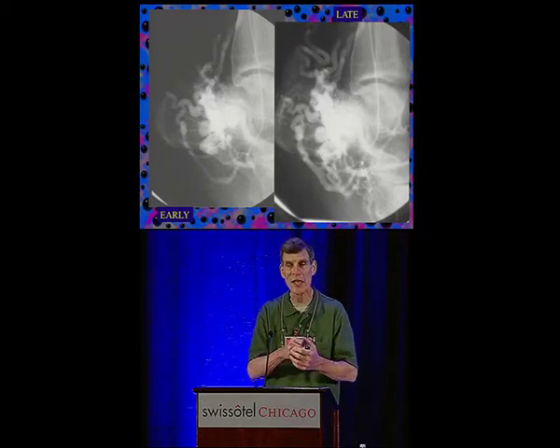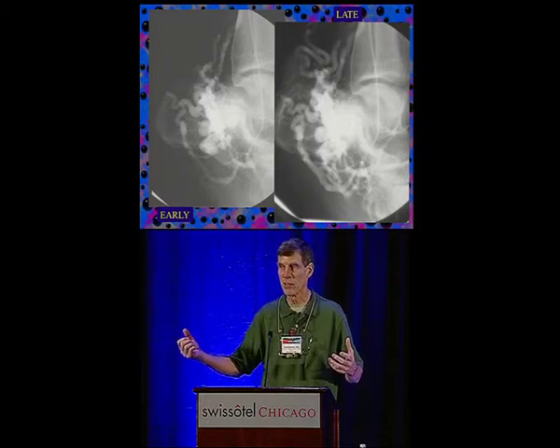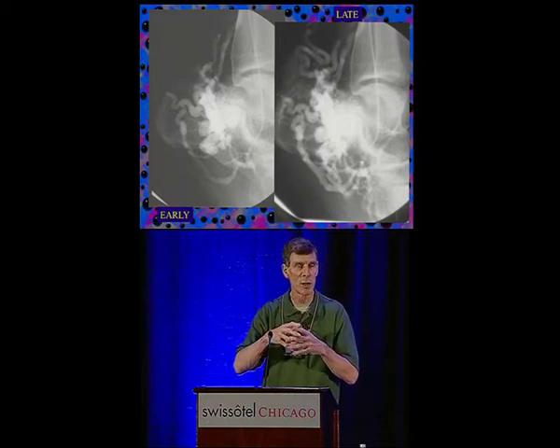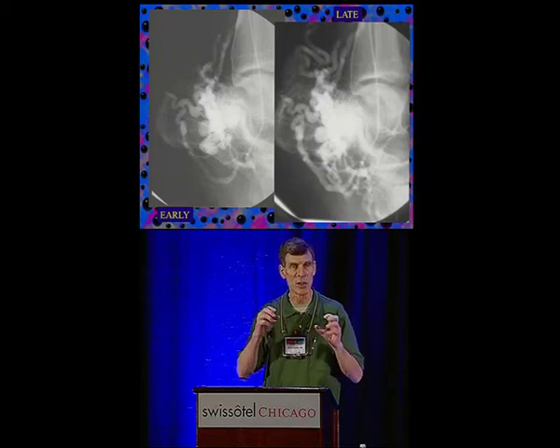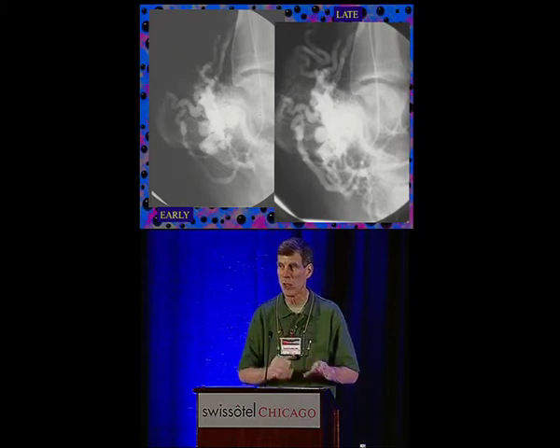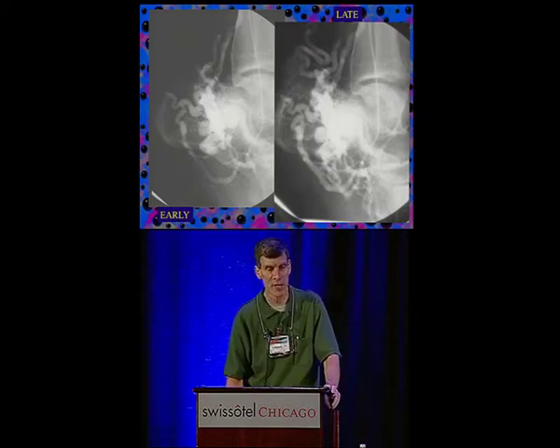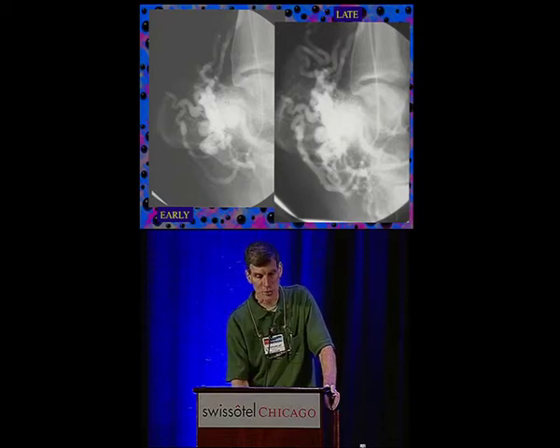So when we take the wrap off so that all these big dilated veins can fill, but we leave the cuff up, there's no flow in from the arteries, so the thing can go back towards the arteries into the nidus because there's no arterial inflow pressure, and it can also fill all the draining veins. So it fills nidus, inflow arteries, and draining veins kind of all at the same time. And you have to be careful so you don't get any major arterial trunks filling.